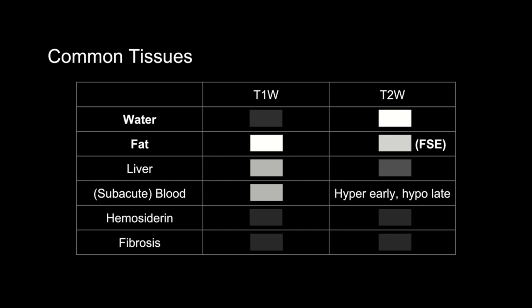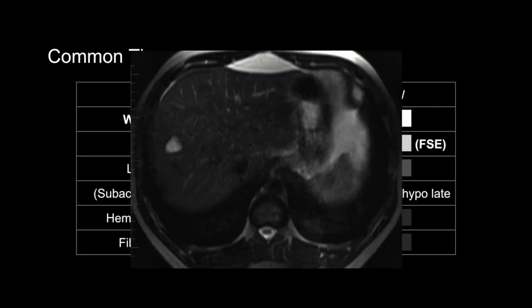If this is confusing you, don't worry. After we get through this introductory stuff, we're going to pull up some MRIs and review all of this stuff again. For now, look at this image. This is a T2 weighted image through the upper liver. You see the CSF is bright here that's almost like pure water. This is a T2 weighted image. Fat is bright here. The fluid in the stomach is bright. The liver is relatively dark, and we have a focal lesion here that is relatively bright. This happens to be a hemangioma, but notice how good MRI is at contrasting the background liver to the focal hepatic lesion.